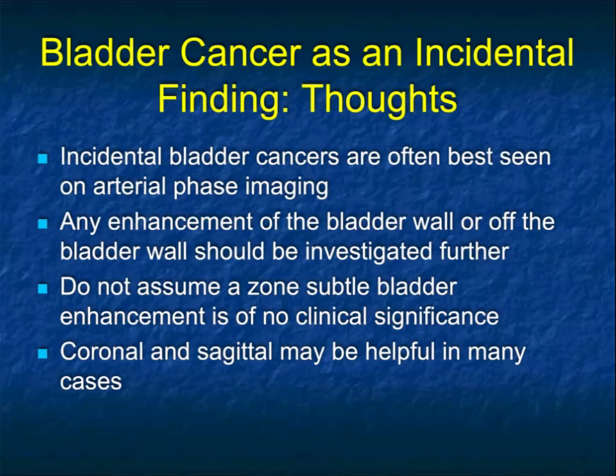so patients will excrete contrast, and it will decrease chances of renal toxicity by hydrating the patient. But we do lots of vascular studies like you do for aortic aneurysms, for example, rule out dissection, follow-up aneurysms, pre-TAVR, you name it. So you're doing older patients who have an increased risk of cancer. Now, we're giving oral contrast for hydration, but that also distends the bladder. And now when you scan the patient, you're scanning through the bladder typically in arterial phase.